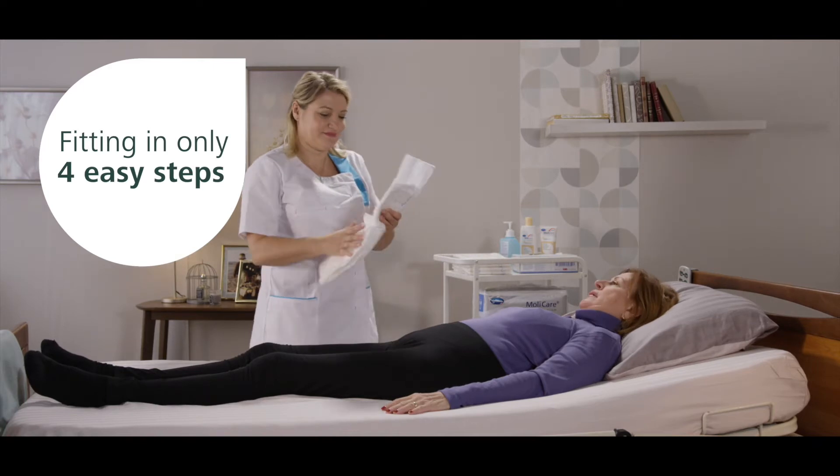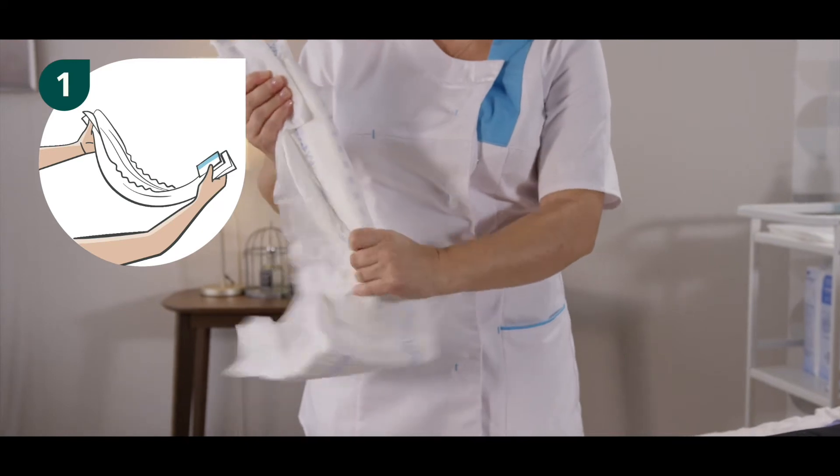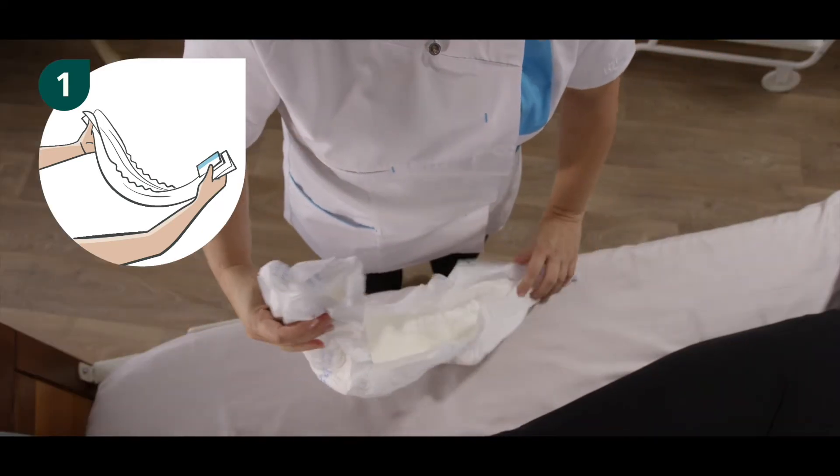The application can be performed in four simple steps. Step one: fold the product lengthwise along the central wetness indicator in order to activate the cuffs. Do not unfold the side panels yet.